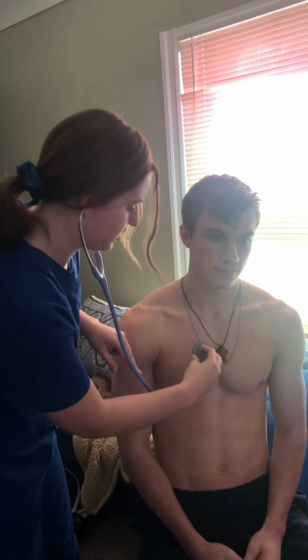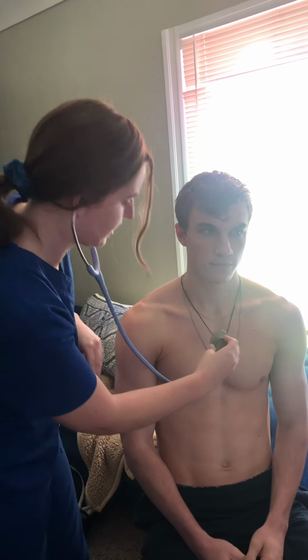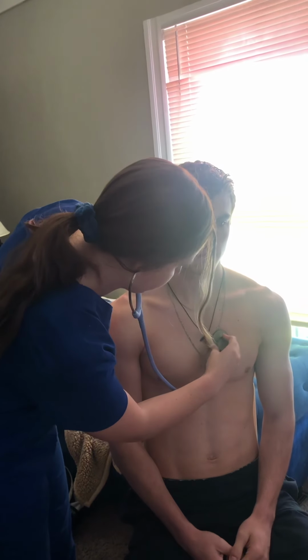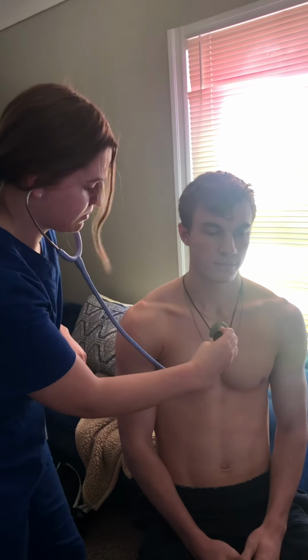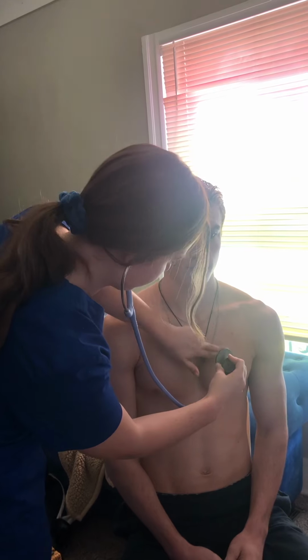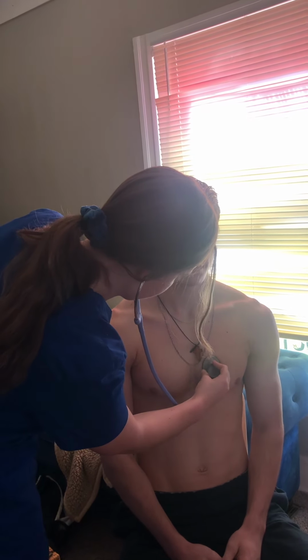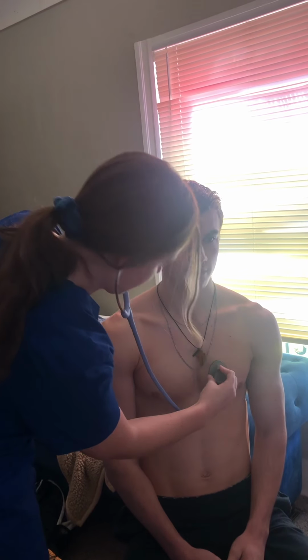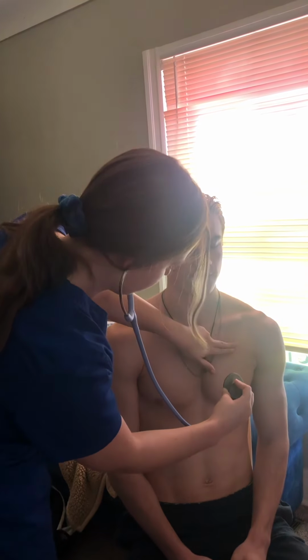And then I'm going to move to the pulmonary, which is in the second intercostal space, but on the left side of his body. Then I'm going to move to Erb's point, which is in the third intercostal space on the left side. And then I'm going to move to the tricuspid, which is in the fourth intercostal space on the left side.